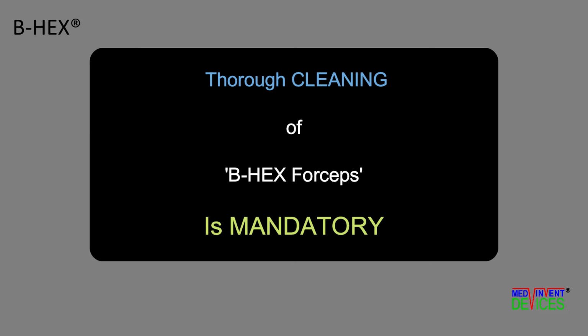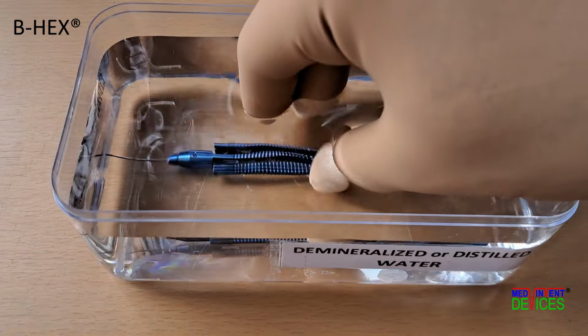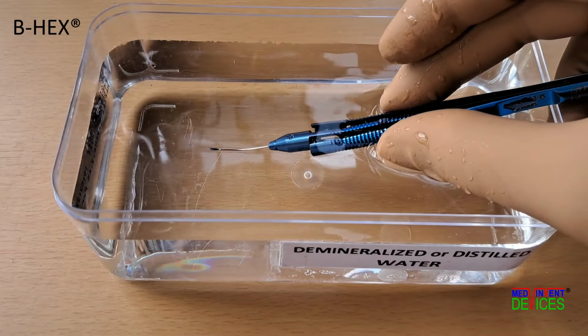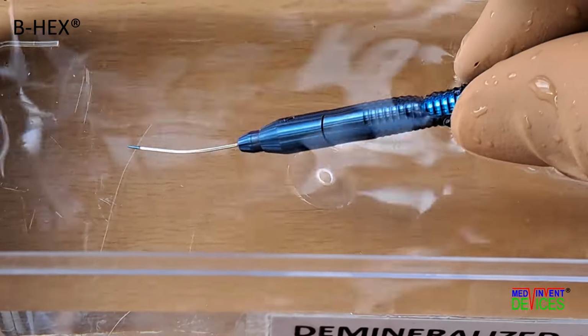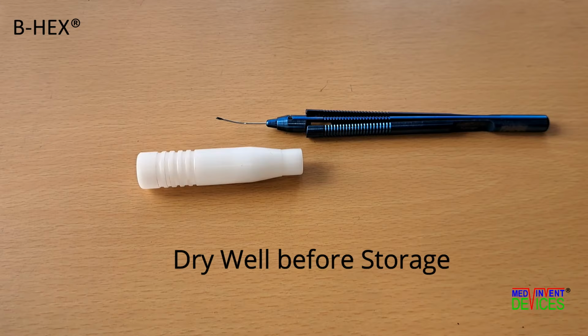Thorough cleaning is mandatory, as viscoelastic gets caked inside the tubular stalk and damages the forceps. After use, the B-HEX forceps should be immersed in demineralized or distilled water for 15 minutes, followed by repeated squeezing of the handle so that residual viscoelastic is washed out. The B-HEX forceps may be cleaned in an ultrasonic bath too. The forceps is to be dried well before storage.